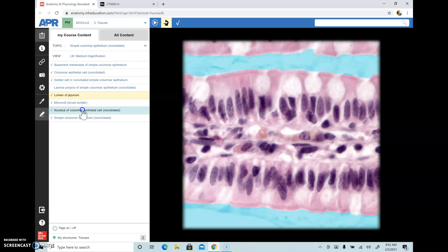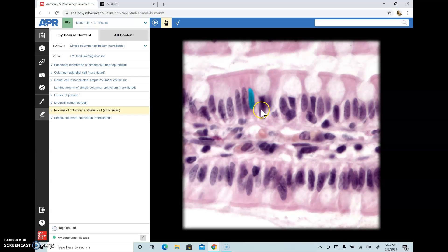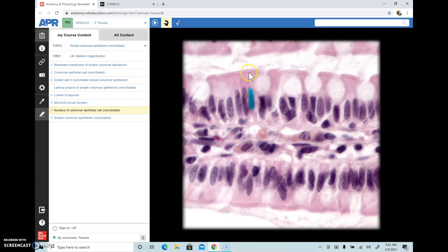Here you see the nucleus of the epithelial cell, and this one becomes the nucleus of the goblet cell. When you're looking at a goblet cell, it's going to be in a columnar epithelial tissue. Wherever the mouth of the goblet cell is open, that's going to be the lumen. So this becomes the apical or luminal surface, and this area in blue becomes the basement membrane.